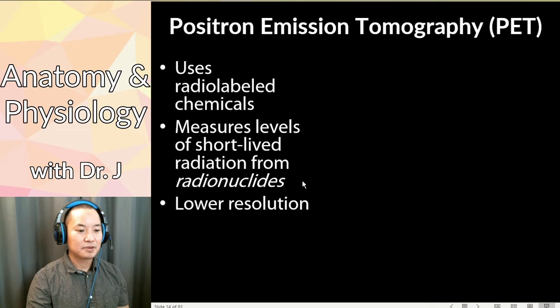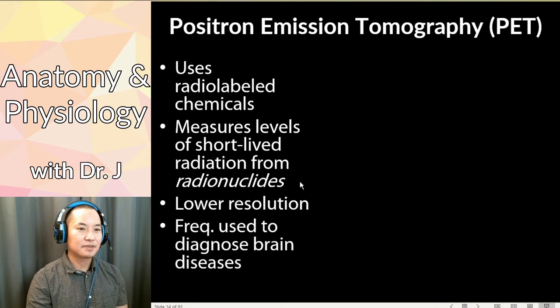These are lower resolution, and they are frequently used to diagnose brain diseases. And let's show you what a PET scan looks like.